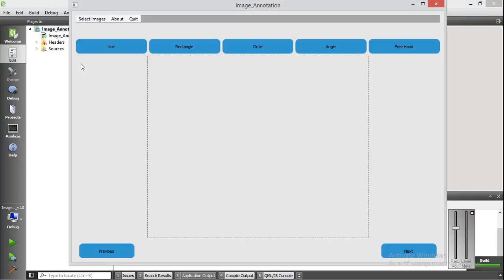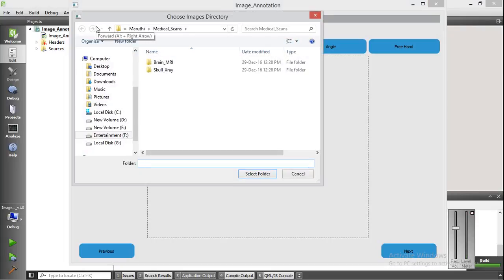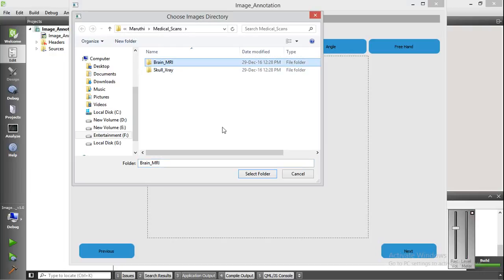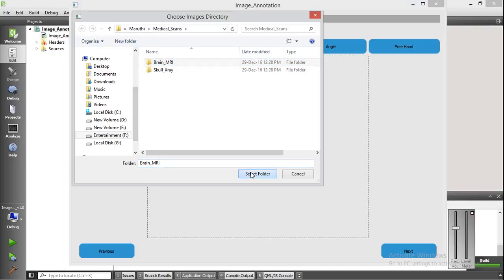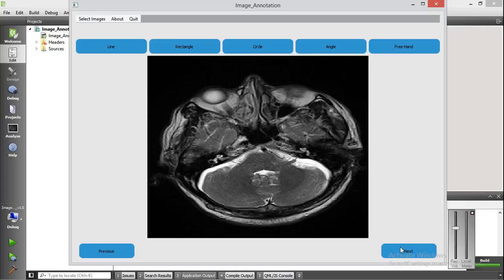In the beginning it will show up this window. We have to select the images that need to be annotated. Here I am selecting, and the images are loaded to the annotation tool, as you can see here.